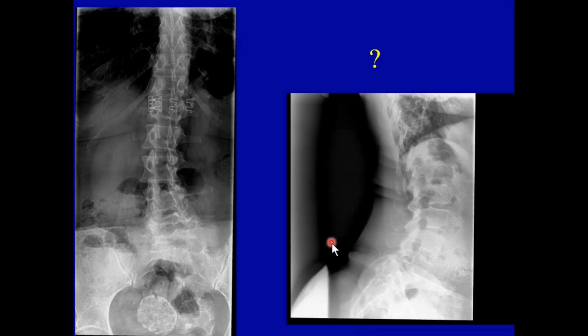If you know how to do them, great. If you don't know how to do them, the first question is, do we do anterior or posterior obliques? And then go from there.